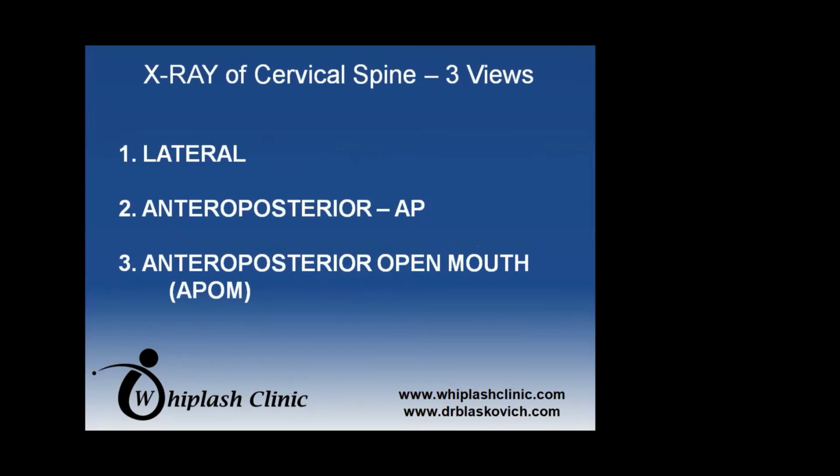And I'm not quite sure as to why that is, but we have a lateral, so a side projection of the neck, and then there's an anteroposterior, or what would be then called an AP view, if you ever see that on an X-ray report. And then we have an anteroposterior open mouth, which is an APOM.